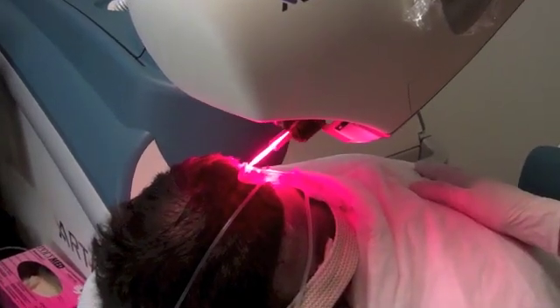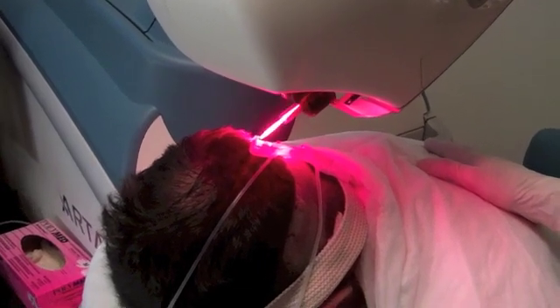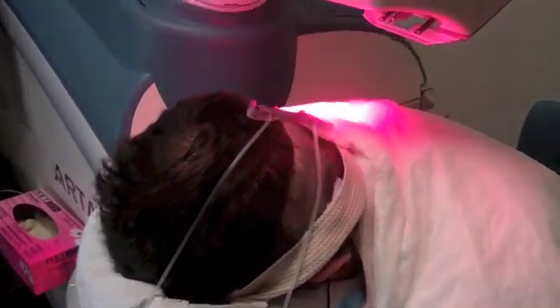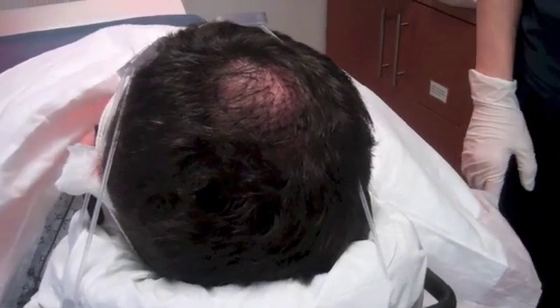You can see the harvesting in a painless fashion. How are you doing down there? Great. Easy? It just feels like a slight pump. But you're not feeling any pain or anything? No, I don't feel anything.